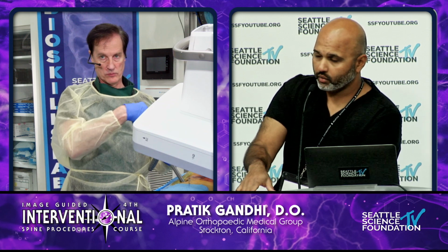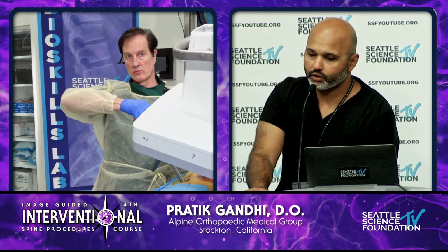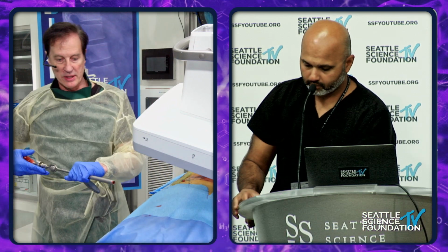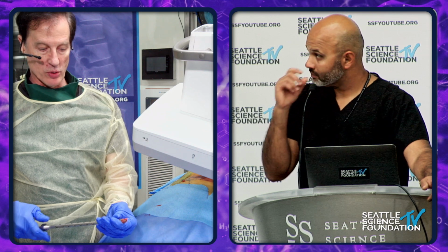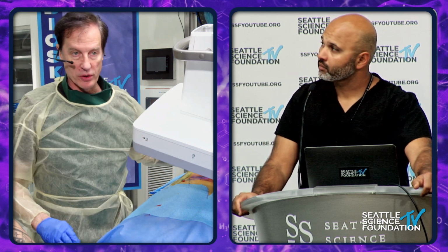So I'll ask one. How many diagnostic procedures or injections are you doing before jumping into the fusion? So let's take the NASS guidelines, for example. They'll recommend two, one diagnostic and one therapeutic, before you go on to the implant, before you go on to the fusion.